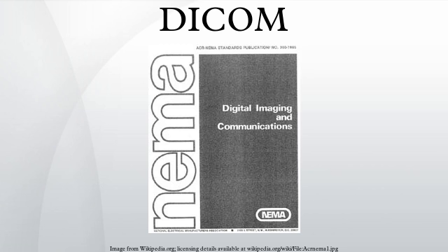This is similar to the way that image formats such as JPEG can also have embedded tags to identify and otherwise describe the image. A DICOM data object consists of a number of attributes, including items such as name, ID, etc., and also one special attribute containing the image pixel data. A single DICOM object can have only one attribute containing pixel data. For many modalities, this corresponds to a single image. But note that the attribute may contain multiple frames, allowing storage of cine loops or other multi-frame data.